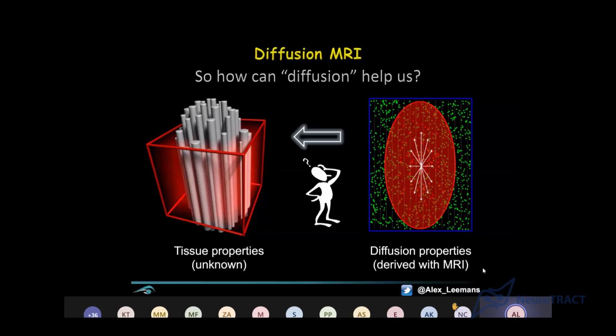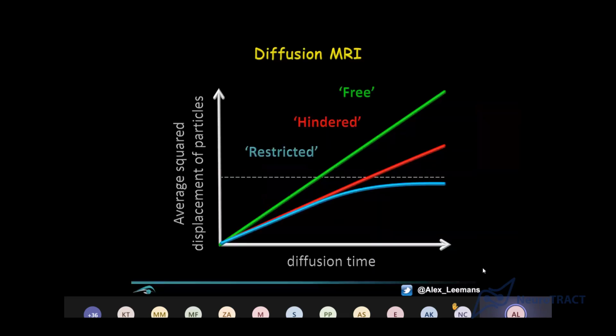So diffusion MRI is becoming very popular, especially in longitudinal designs, meaning following up people. So you scan them, and then, for instance, you monitor disease progression, or look at the effect of therapy, like radiotherapy, or even chemotherapy, or other ways to look at potentially solving or mitigating the disease. I hope that makes sense.